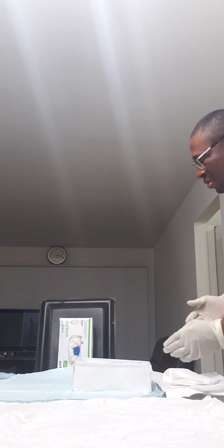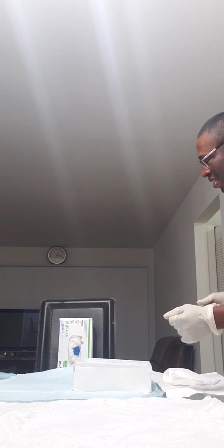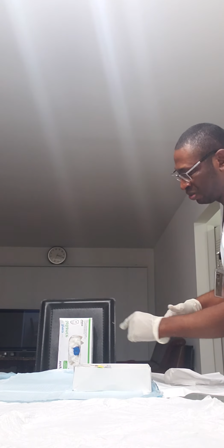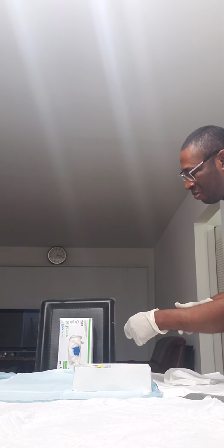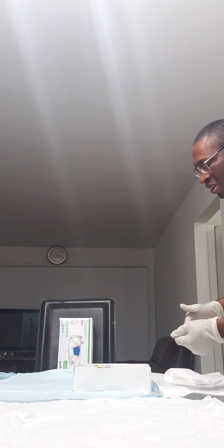Hi Jane, I'm here now. So we're going to start the procedure, okay? All right. Can you take a deep breath? Out. Okay, good. All right. Okay, so first of all, I'm going to do the pericare. After the pericare, then I'll insert the Foley. Okay. All right. Thank you.